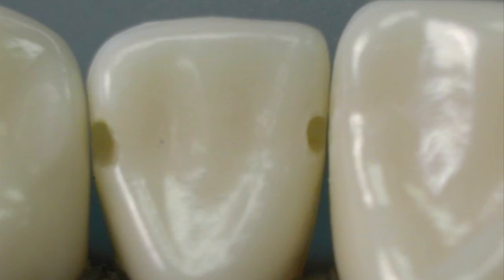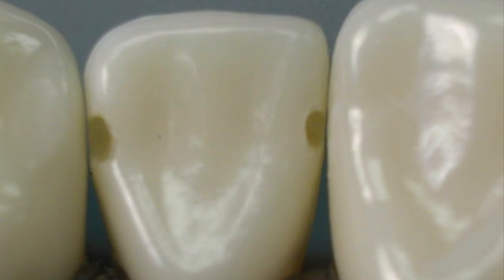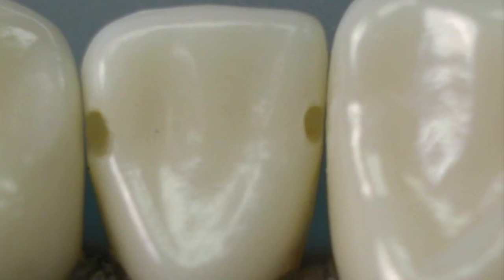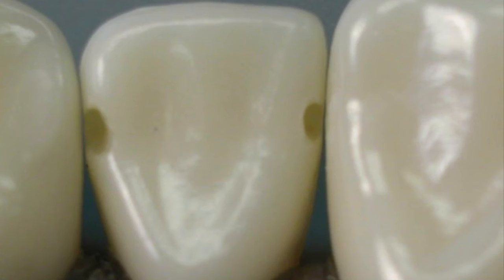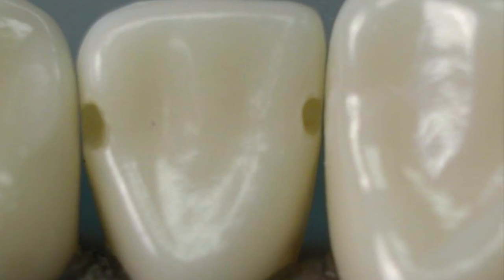A lingual access is preferred for your class 3 restoration because the restoration will not be visible to your patient. Over time, composite can discolor and the margins can stain. If the restoration is on the facial, this will usually require replacement. However, on the lingual, since the patient cannot see it, this will not be failure of the restoration. If the carious lesion extends very close to the facial wall, a thin layer of enamel can be left for aesthetics. However, in your preparations for preclinic, you will just minimally break facial contact.